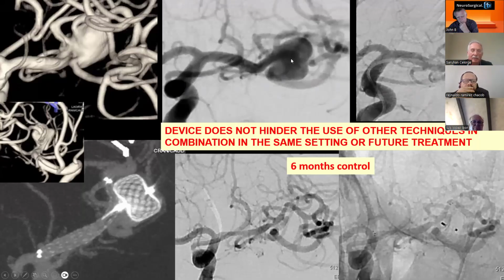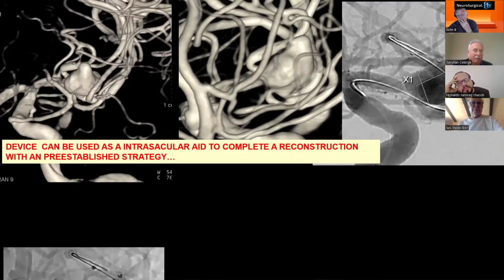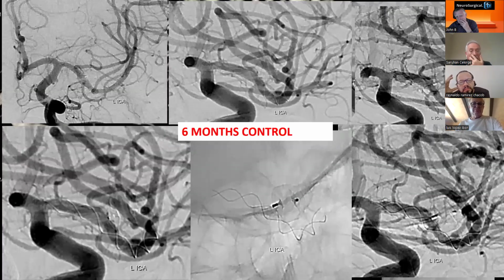You predict that the device is going to hinder the flow, and you don't detach, and you bypass with a catheter, bouncing your wire to the WEB device, and you do stent-assisted WEB device treatment. So you can tailor these treatments in these particular cases. So you can come up with a pre-established strategy. You wire this inferior trunk that you predict a WEB device is going to hinder the flow. Then you place a stent after the treatment, and this is the 6 months follow-up after the baby Leo and WEB device treatment.